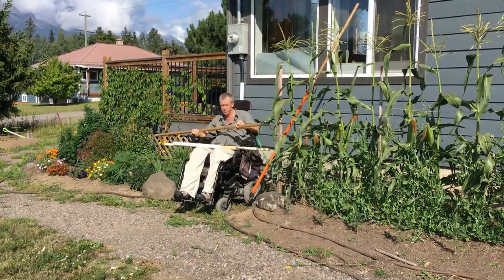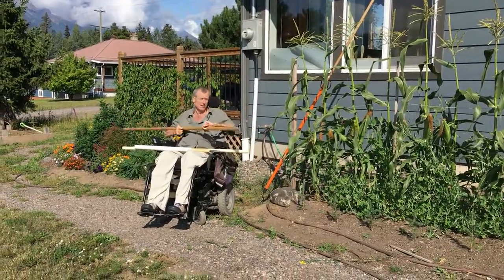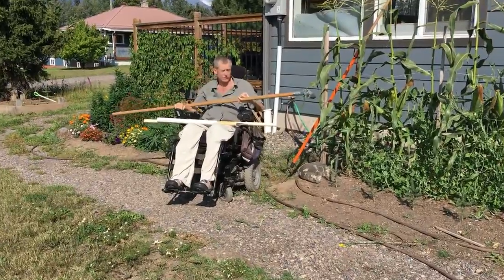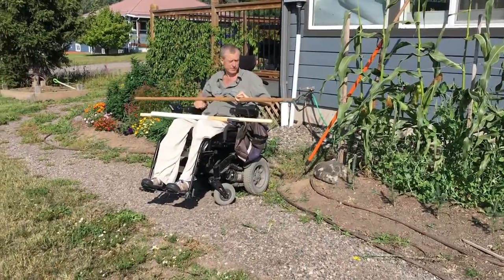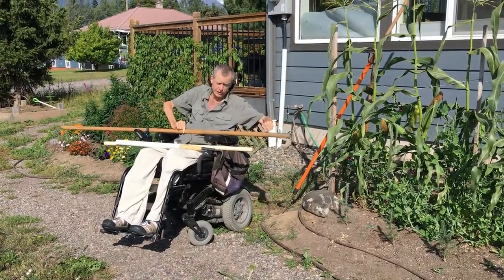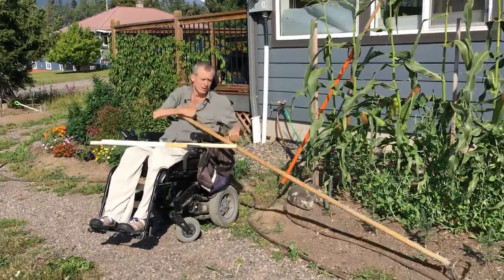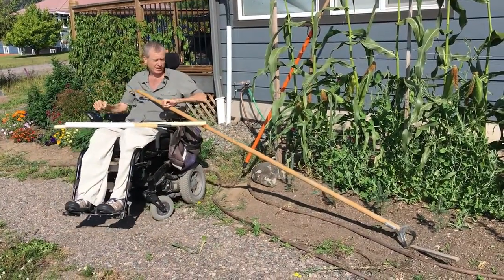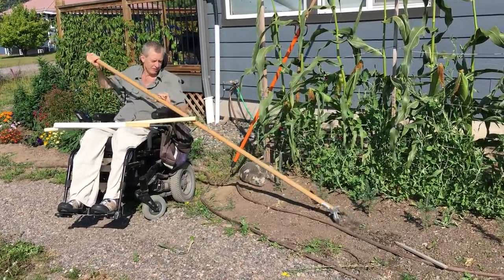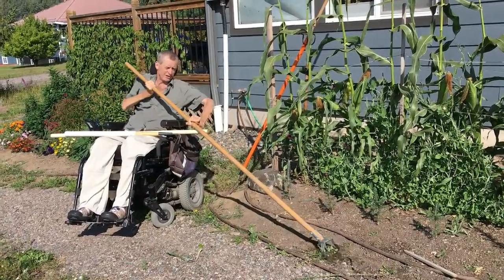is what I call a stirrup weeder. I have no idea what it's called actually. It looks like that. It's just a thin piece of hardened steel shaped like a stirrup. And it came with another 4-foot handle. But I took the whole handle off and I just bolted on another piece of wooden doweling, which is about 6 or 7 feet long also. Once again, you can just chuck it down like that. Get on it and take out some weeds.